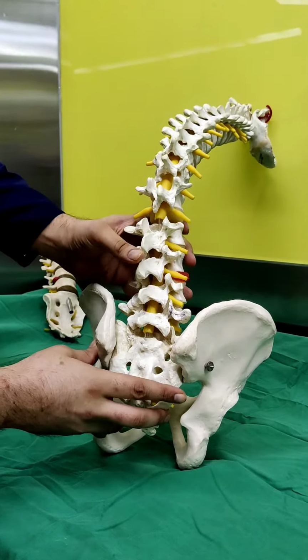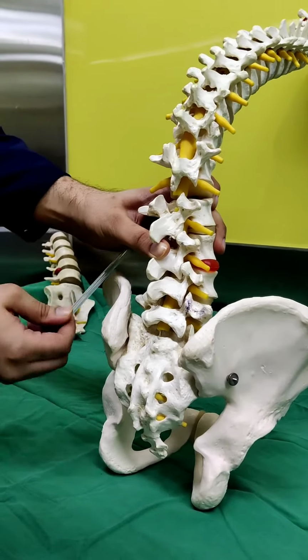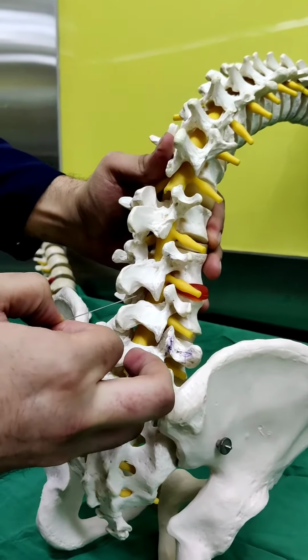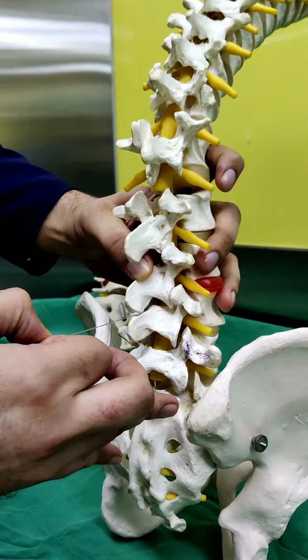So if the patient is not properly positioned or the spine is not flexed, we can see the needle entrance will be very difficult. I'll show you once again. If the patient is given proper positioning and the back is flexed, needle entrance will be easy. And if the patient is not in a flexed back position, we'll hit bone as soon as we enter the skin.